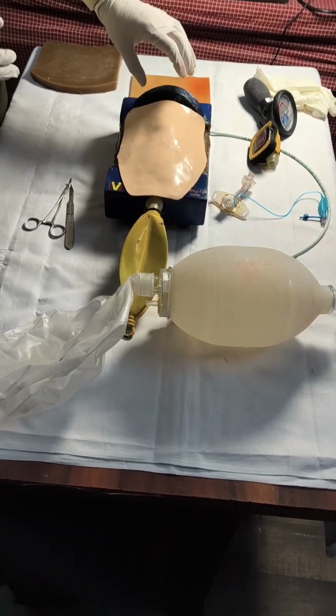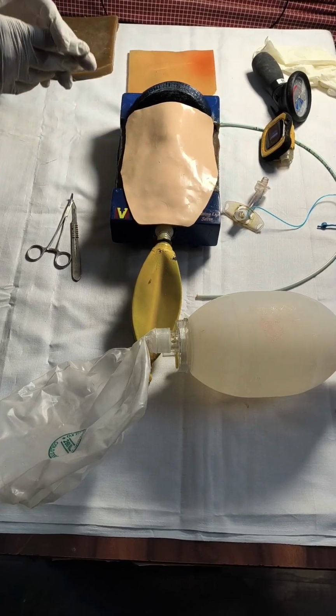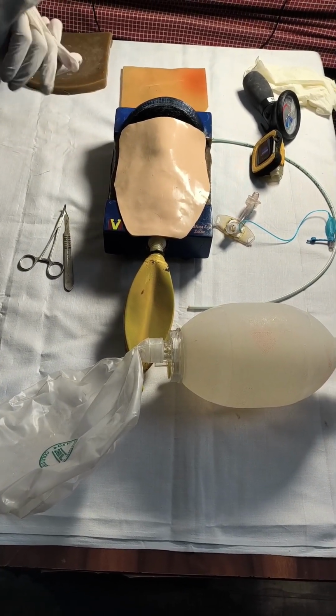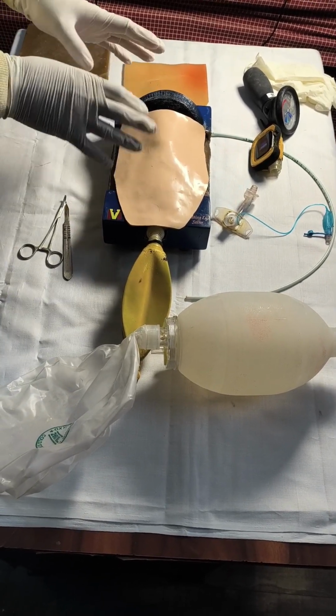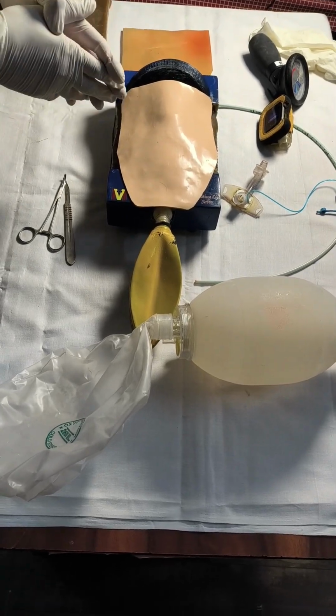So we marked the cricothyroid membrane by doing an ultrasound, then we did the Cric. And what next? As I told you earlier, then we need to do deliberate practices. For doing deliberate practices, we have designed this mini model of surgical cricothyroidotomy. There are two ways you can do deliberate practices.